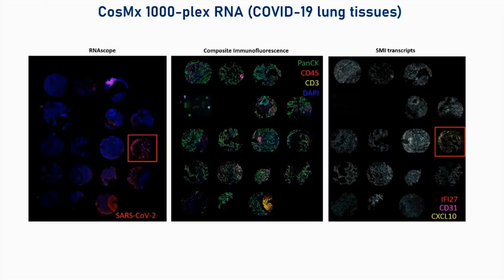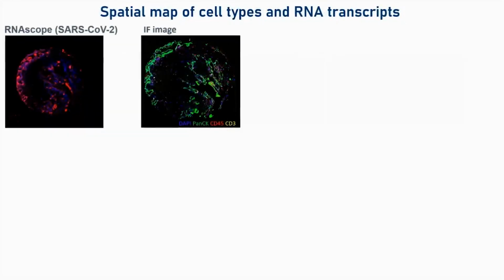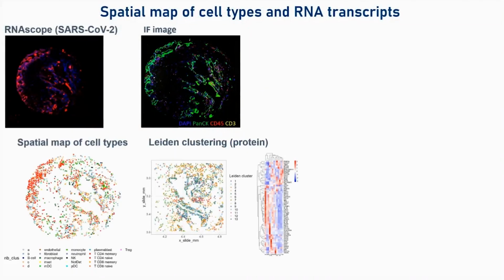And so we could then look at the same approach that we used at a multicellular readout. We could take the RNA scope data, overlay that with the multiplex immunofluorescent data, and then look at the transcript level readout using this approach. And so what we could see is this is now just digging down into a single core from a single patient. We've got the RNA scope in the top left, the multiplex IF image in the top right, and we can now cell type, I'll go into that in the next slide, and look at the individual cell types within this tissue.